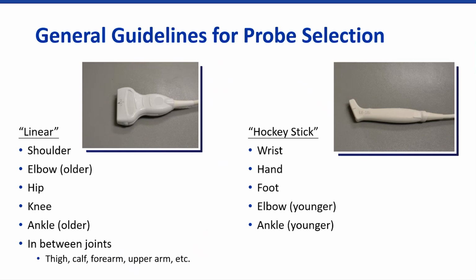You can see for some of the bigger joints, bigger spaces, I'm going to use that standard linear probe. And if I'm around the foot, ankle, or you don't have as much space to work with, I want that smaller footprint there, okay?